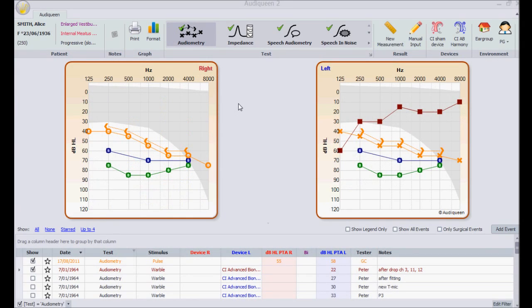Here are some tips and tricks with respect to the list of test results. Audiquin allows me to manipulate this list in several ways. I can get a view on all test results by deselecting a specific test.